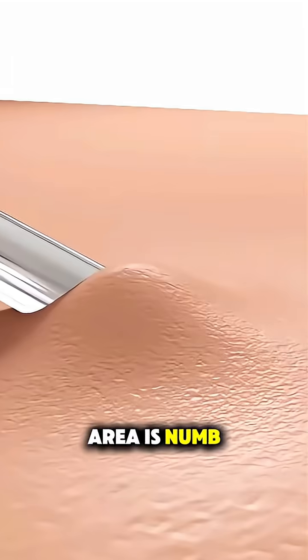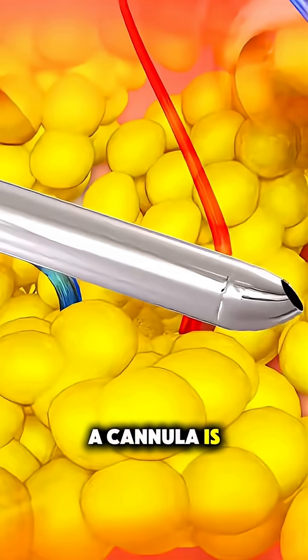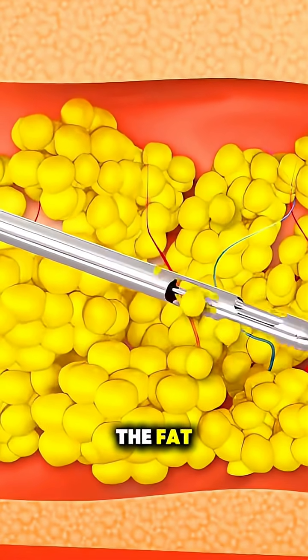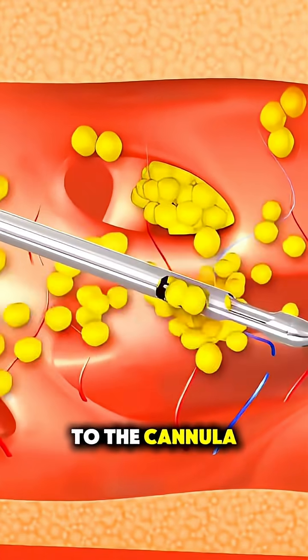Once the area is numb, a small incision is made and a thin, hollow tube called a cannula is inserted. This cannula is moved back and forth to loosen the fat, which is then suctioned out using a surgical vacuum or syringe attached to the cannula.